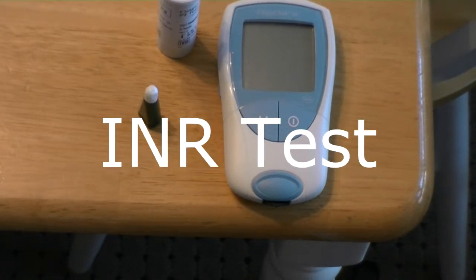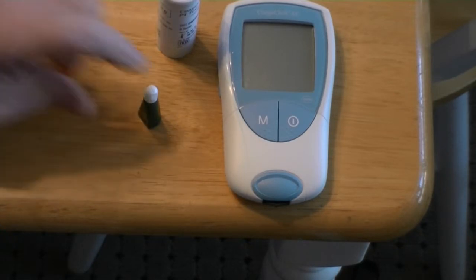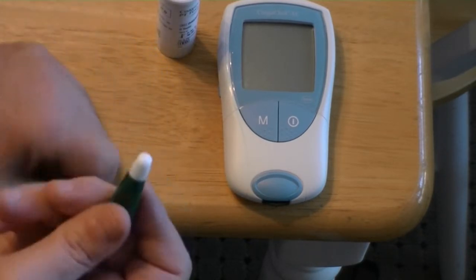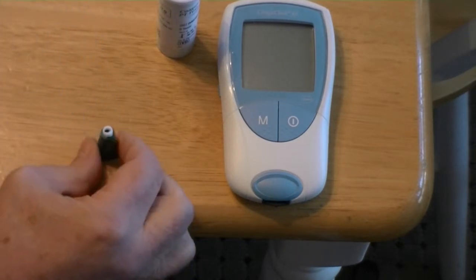We're going to test my INR using the test meter, test strip, and the lancet. You take the lancet and twist it — that arms it.